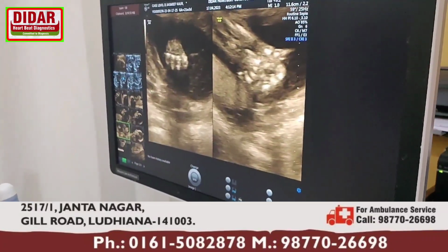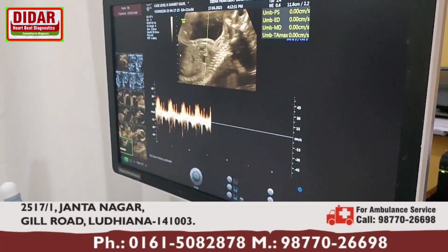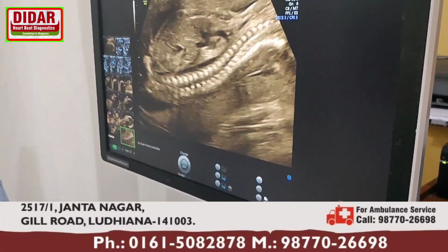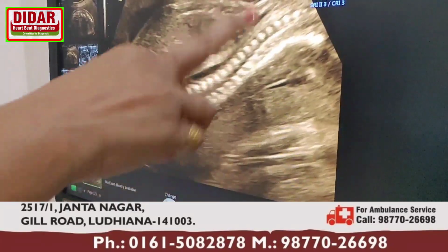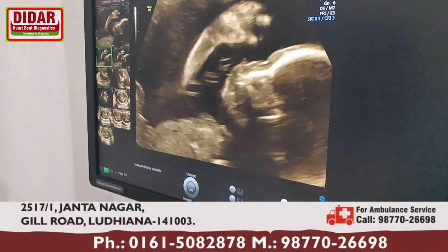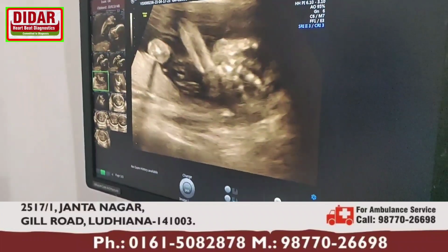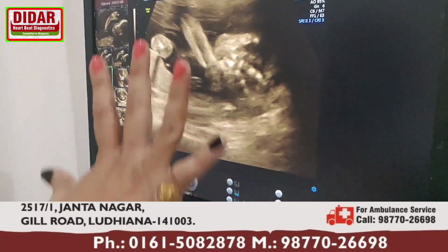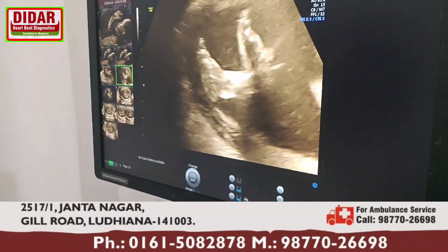Then again hands, I am able to see, this is again the fetal face. Then we measure the heart rate. Now the baby has moved to the other side, so the spine has gone to the other side, towards the back of the mother. Then hand in front of the face. Again I am able to see four fingers in the image, though actually there are five. Then again I am seeing the feet.